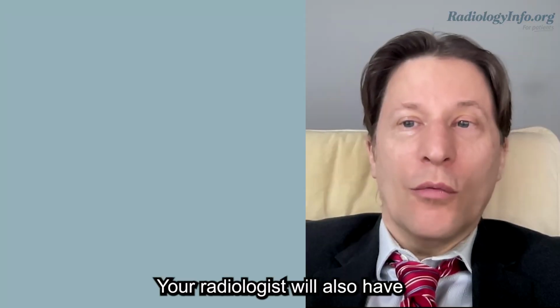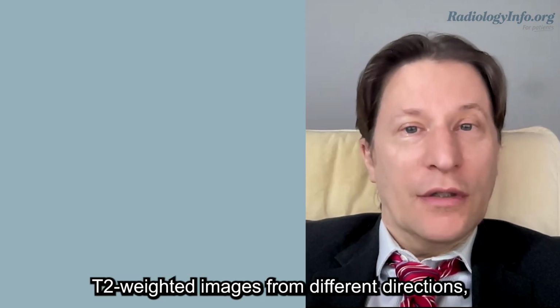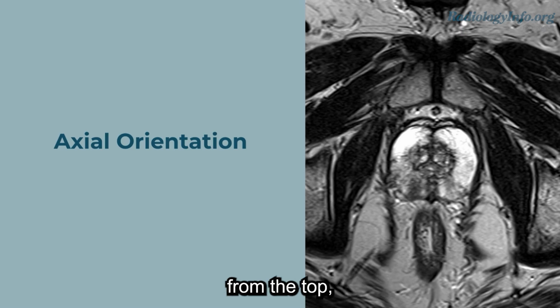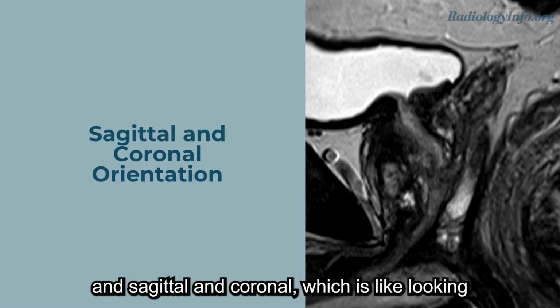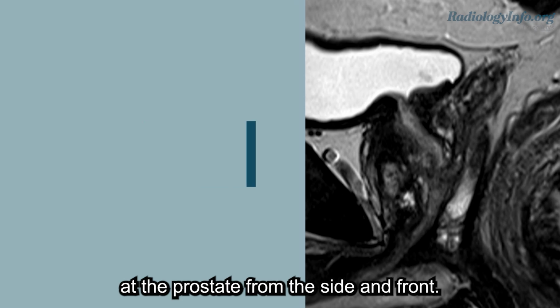Your radiologist will also have T2 weighted images from different directions, including axial, which is like looking at the prostate from the top, and sagittal and coronal, which is like looking at the prostate from the side and front.